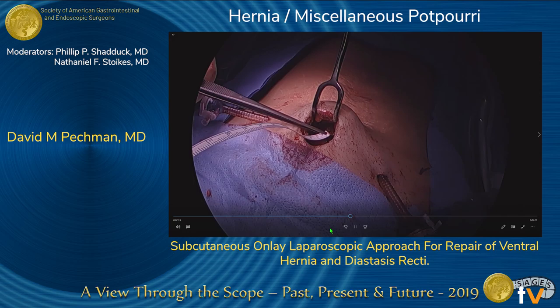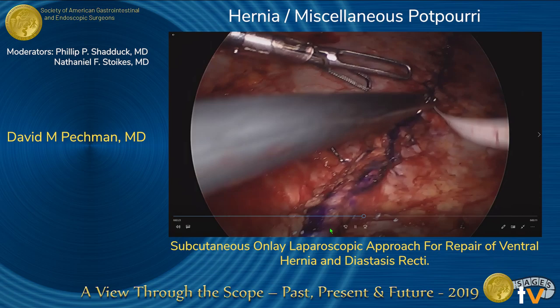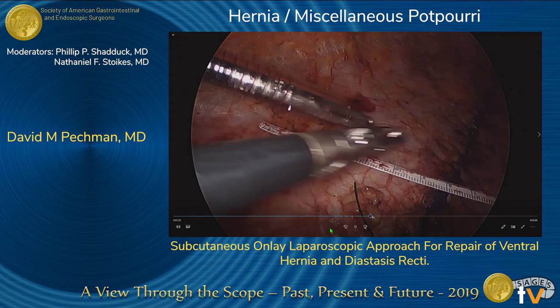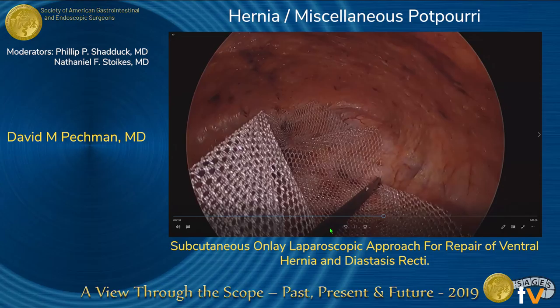A ruler was introduced in order to assess what size mesh would be accommodated in the subcutaneous space. The defect was 25 centimeters from the xiphoid to the pubic bone and 15 centimeters horizontally. The macroporous mesh was cut to a size of 25 centimeters by 15 centimeters with rounded edges, then introduced into the subcutaneous space.